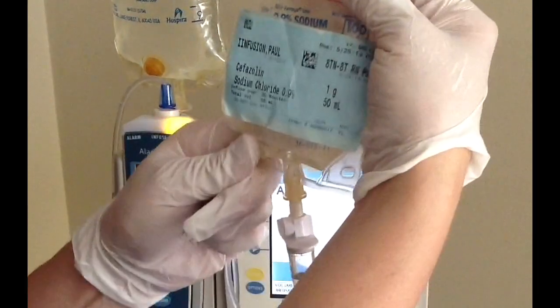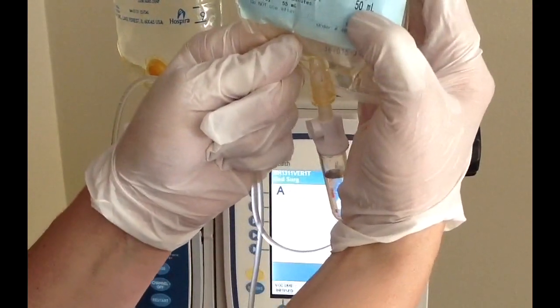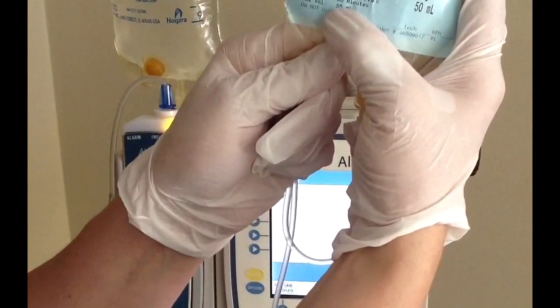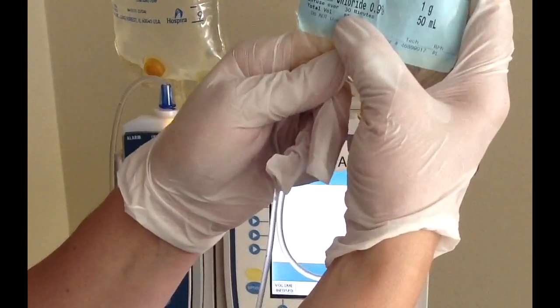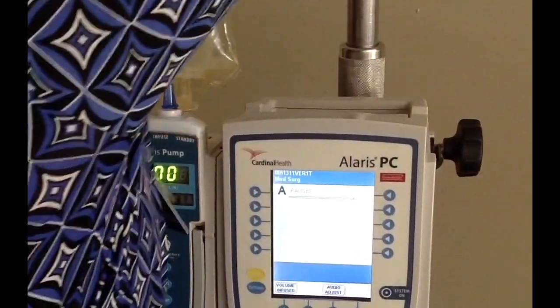Another thing to note on your bag here is the label, which is showing you that it's a 50 ml bag, but if you look in the bottom left hand corner, it's actually saying the volume of 50 plus the drug equals a total of 55 mils. So we'll need to note that for our programming. Go ahead at this point and hang your bag.